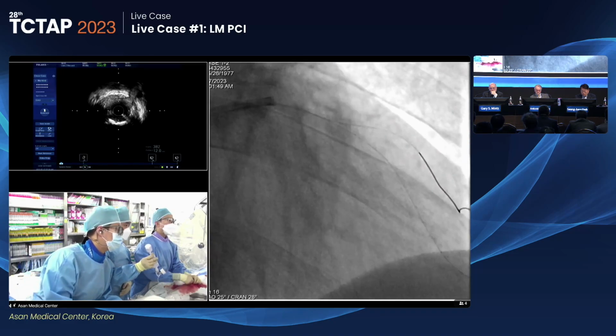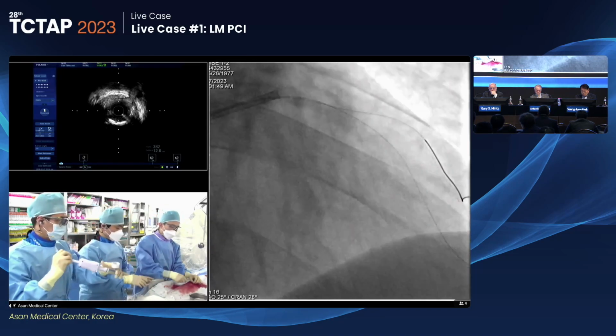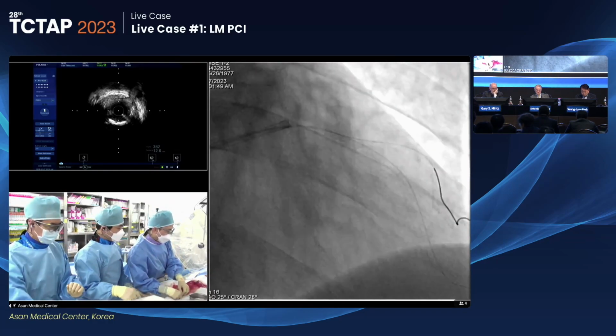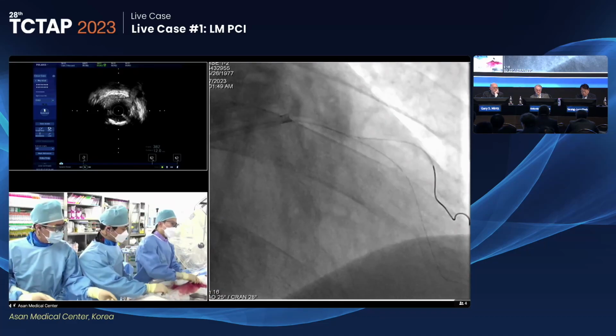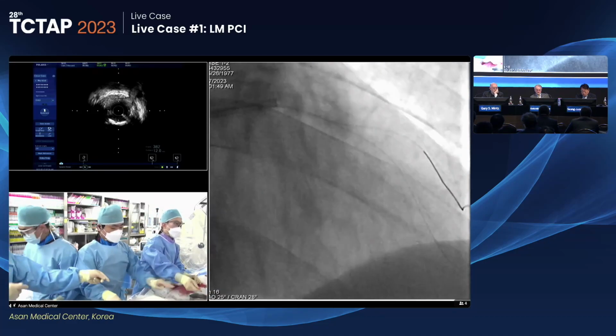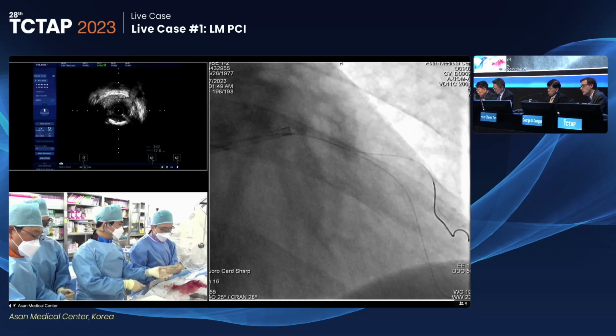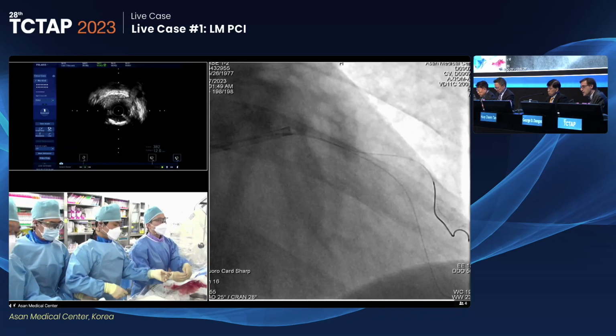We need further dilation, 2.5 NC, please. Yes, as the panel said, we need further. Interesting. We had a lot of shift towards the diagonal. The equipment did not deliver, so it does need a better preparation there.